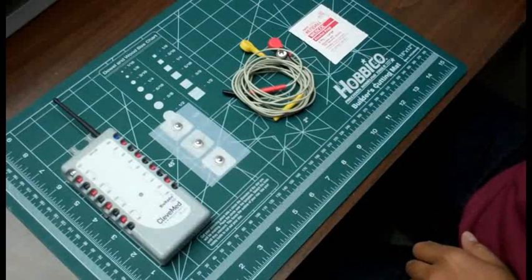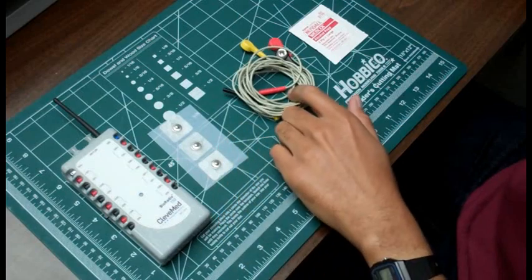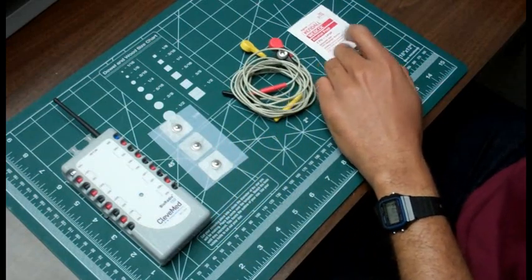This is a quick tutorial for recording ECG with the BioRadio. You'll need the BioRadio, 3 electrodes, 3 electrode cables, and an alcohol wipe.